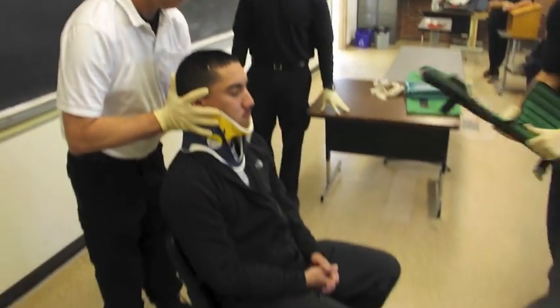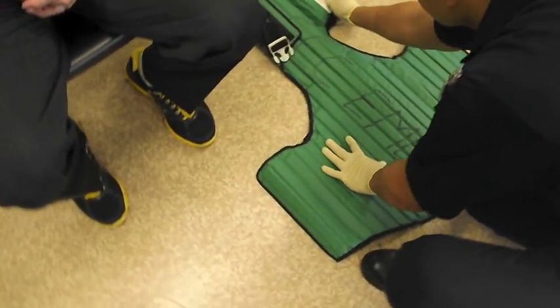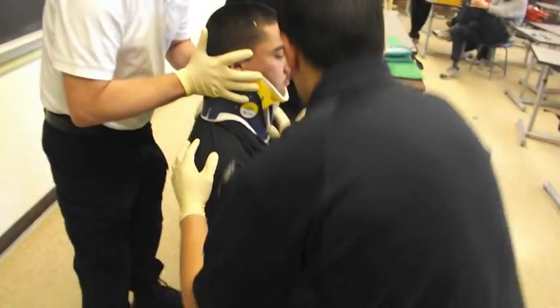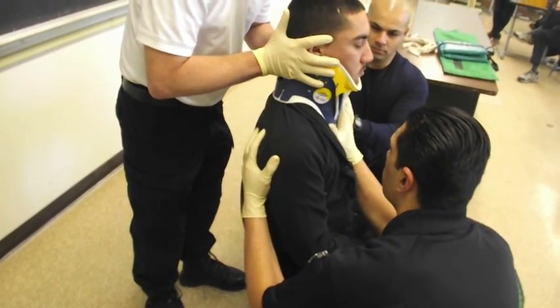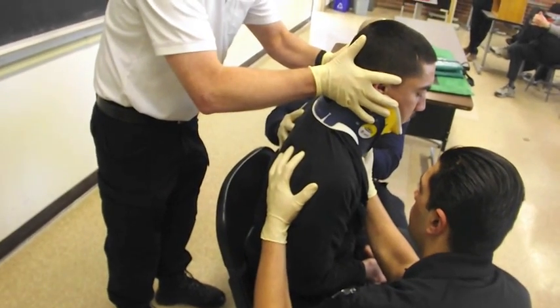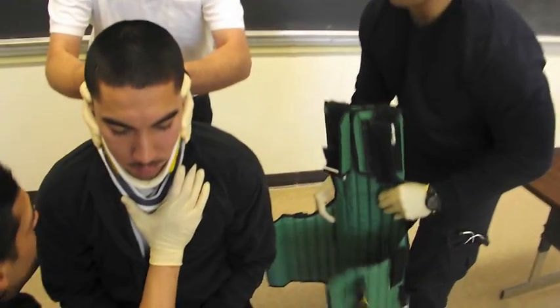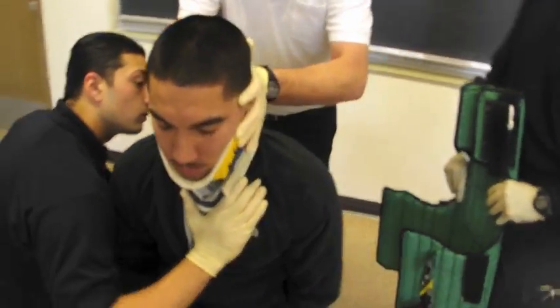Next they will come with their device. On my count, we're going to move forward approximately six inches. One, two, three. The person at the head always is in charge of calling the shots. Before they put this on, they're going to palpate the spine to make sure they don't feel any deficits or any kind of crepitus instability — DCAP-BTLS.